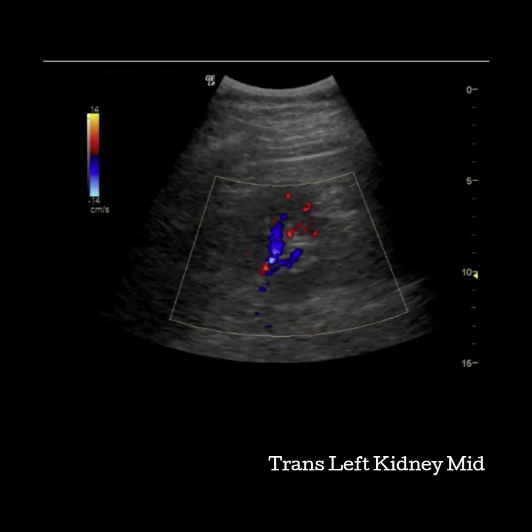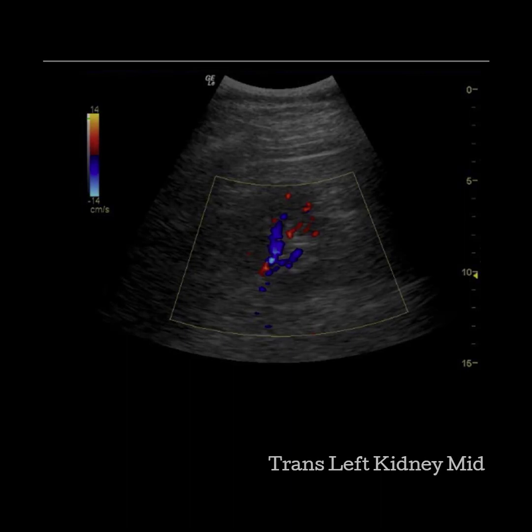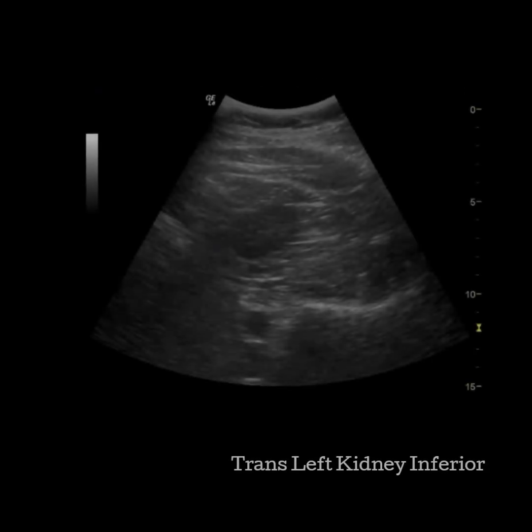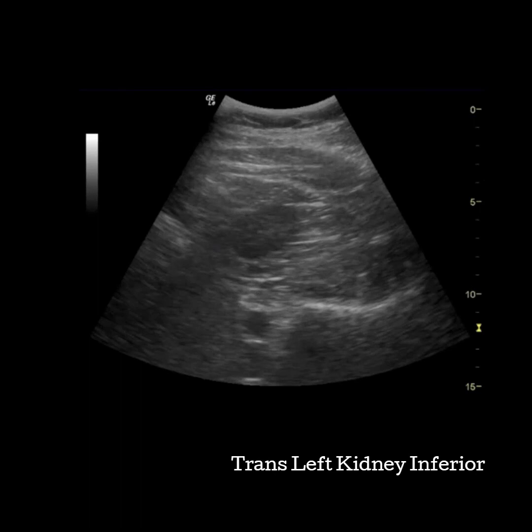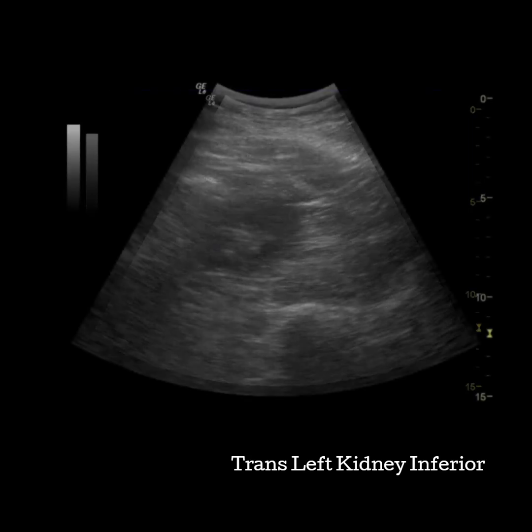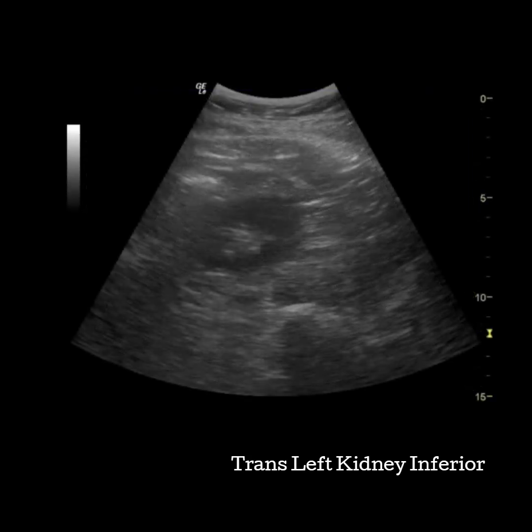Take a color image to see the renal artery and renal vein and highlight the hilum of the kidney. The last image of the kidney is at the inferior pole. Continue sweeping towards the patient's feet; these two images again show the difference between little and no sinus visible.